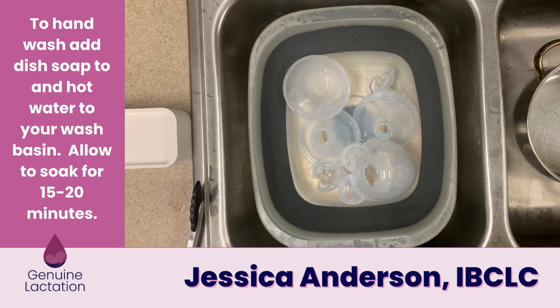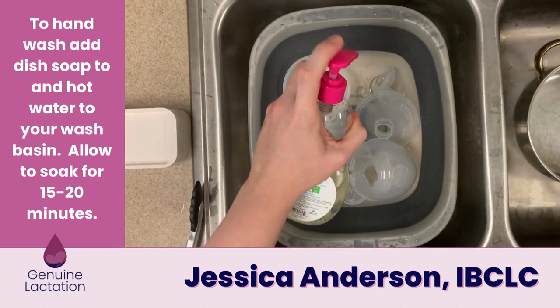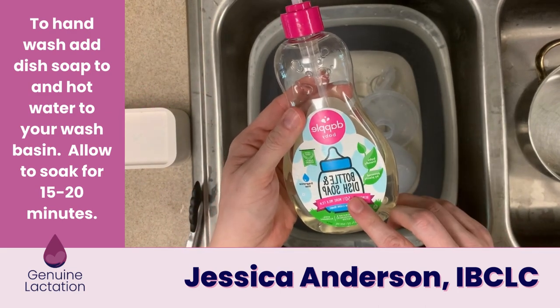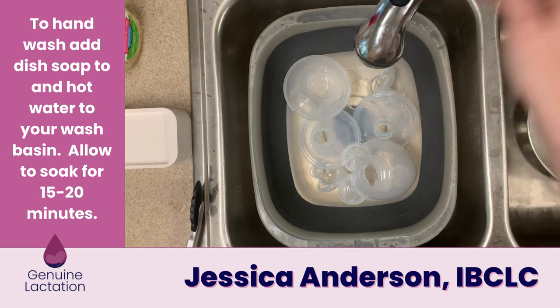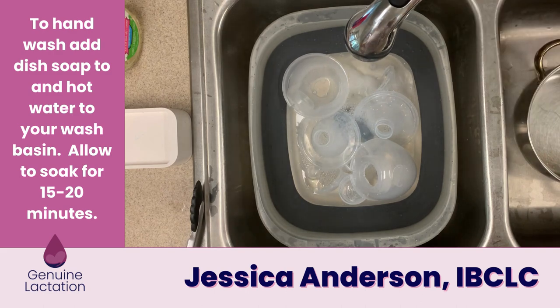To hand wash your pump parts, put all of your disassembled pump parts into your wash basin. Add a couple of pumps of breast milk-friendly soap — I really like the DAPL or the Medela, but you can also use unscented dishwashing liquid. We avoid scented dishwashing liquid because it tends to leave a smell on the parts that can carry over into the milk and some babies don't like it. Then fill the basin with hot water and allow it to soak for 15 to 20 minutes.